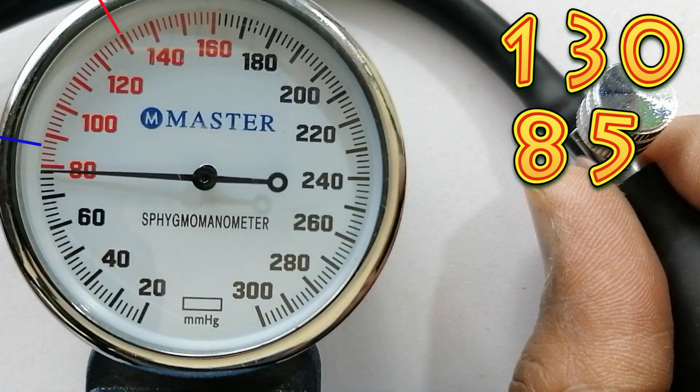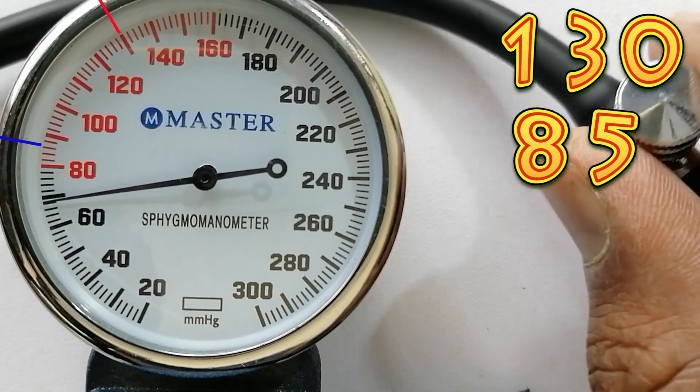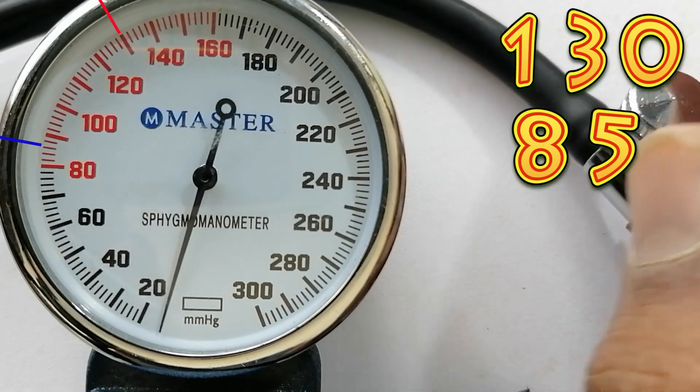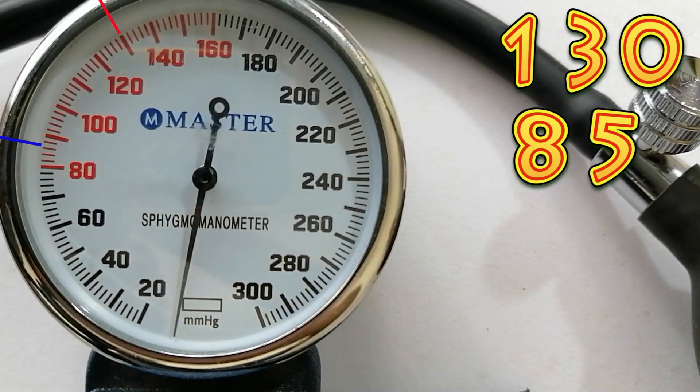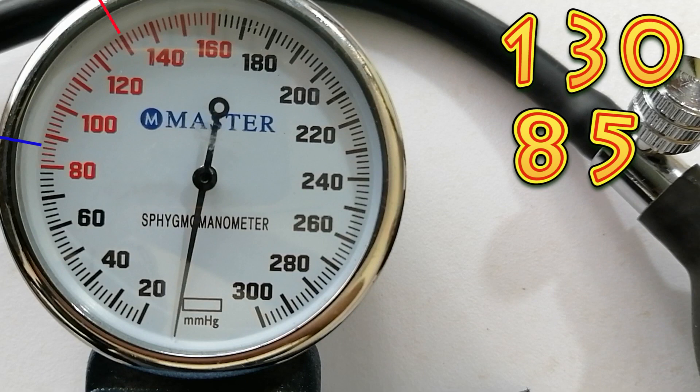Now let me loosen the valve. The first time we heard a throbbing sound at 130, so our systolic blood pressure is 130. The last time we heard a throbbing sound at 85, so our diastolic blood pressure is 85.